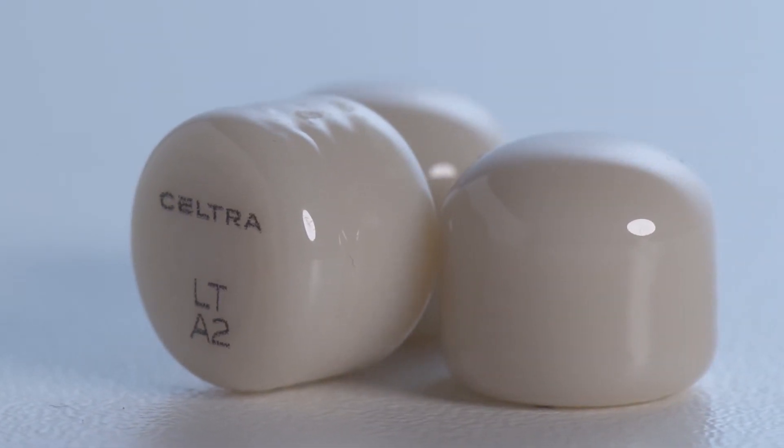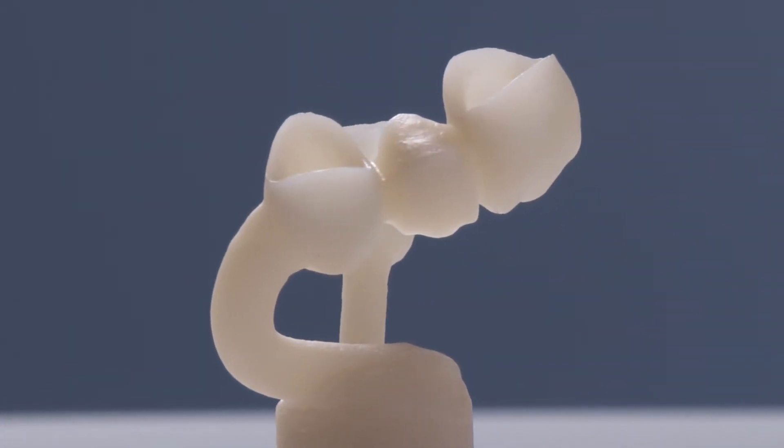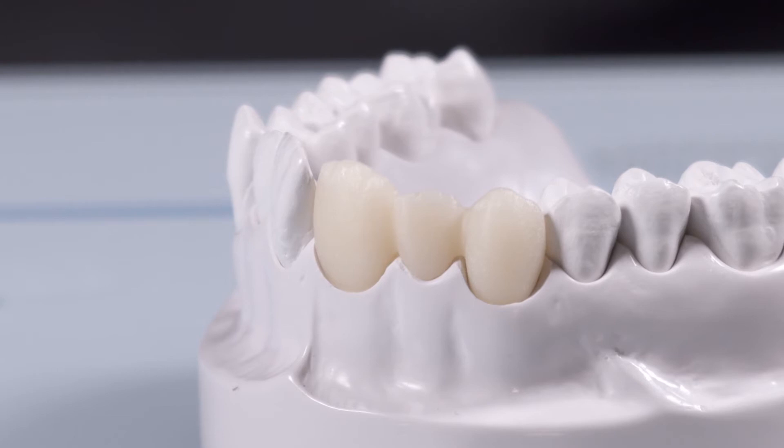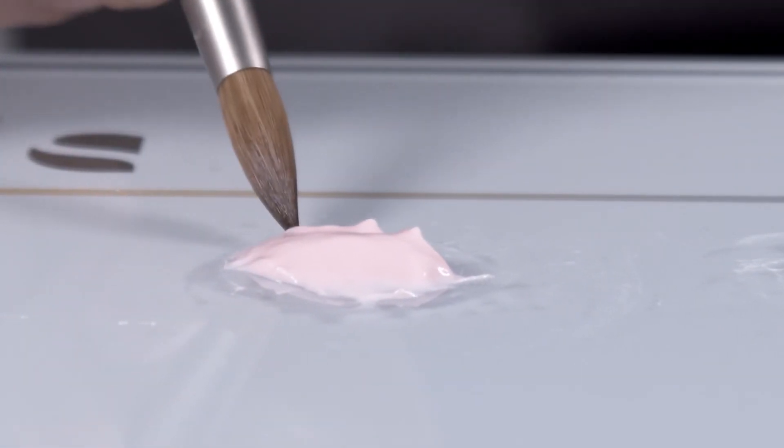In the fully veneered version, Seltra Press offers unlimited top-notch aesthetics. The framework has been designed to reflect the reduced anatomical shape of the restoration. Build up the upper part of the crown with Seltra Ceram Dentin A2 and create delicate mamlon structures.